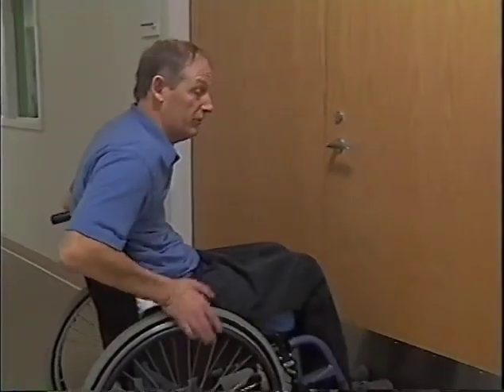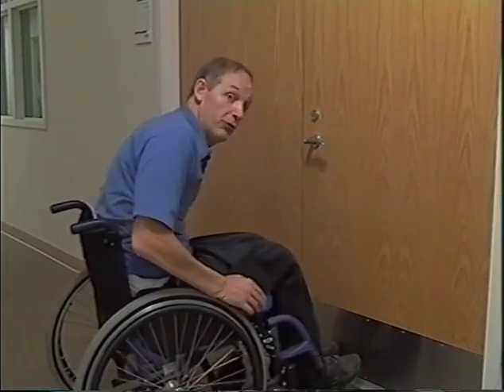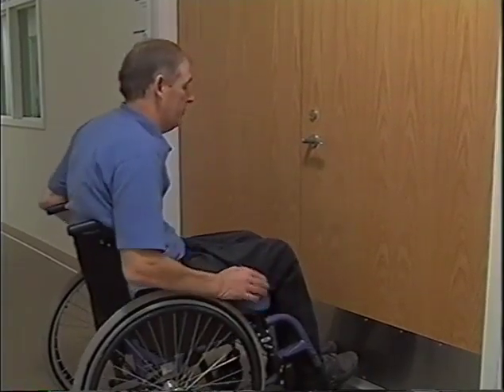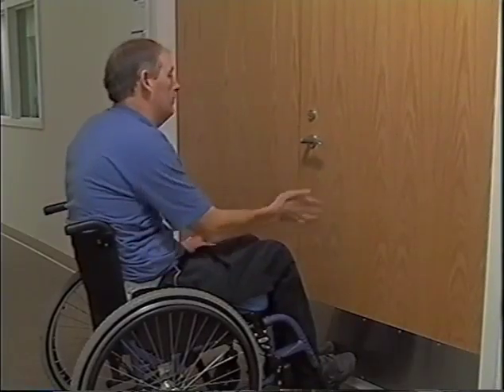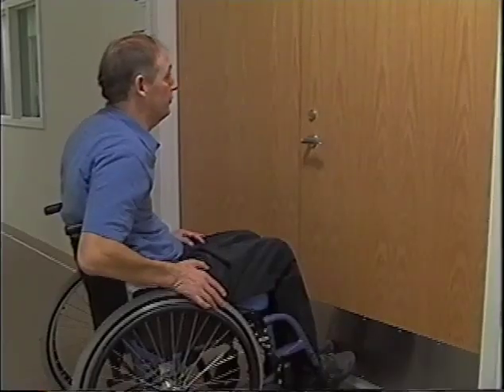When it comes time to go through doors, pushing them open with your feet, first make sure the door is unlocked. A lot of people smash into doors. I don't want you to break your toes, so make sure you have foot protection on. If you're in the hospital setting, don't do these things without having shoes on. When you come up to the door, I want you to come in at a bit of an angle and be as far out as possible to give you as much leverage on the door.